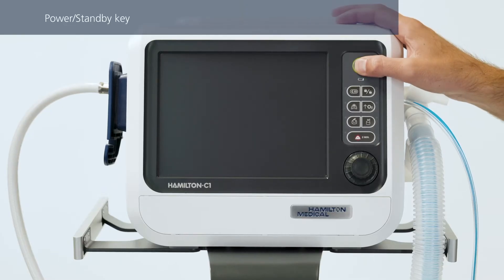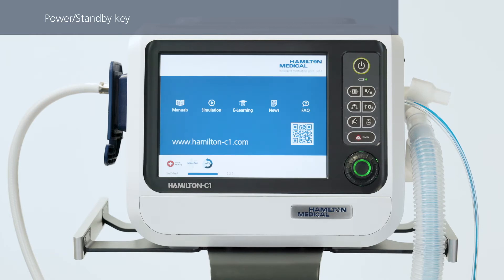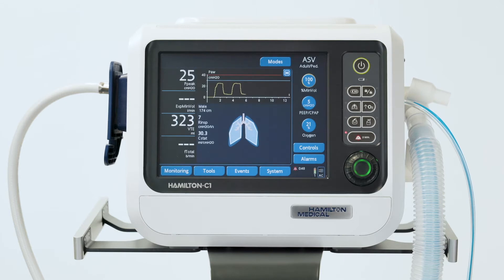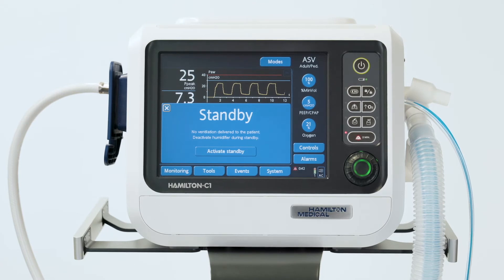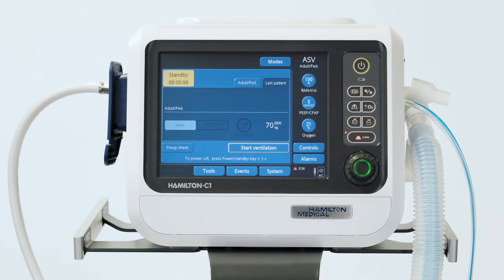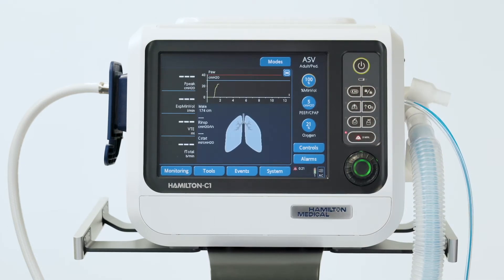Let's start with the power standby key, which is what you use to turn on the ventilator. You can use the same key during active ventilation to stop ventilation. Just press the power standby key and when the pre-standby window opens, touch the activate standby button. Ventilation stops. To resume mechanical ventilation with all the previous settings, just press the power standby key again or touch the start ventilation button.